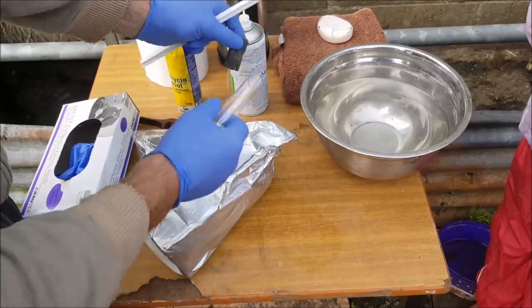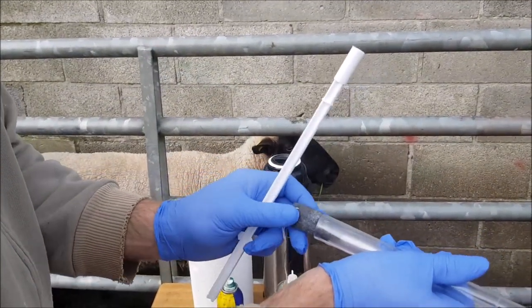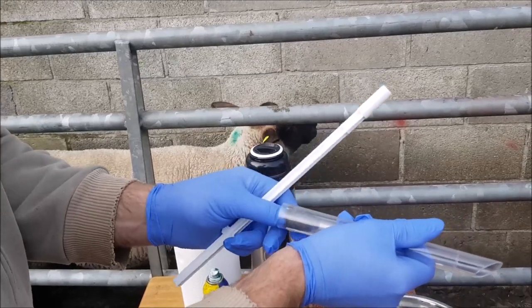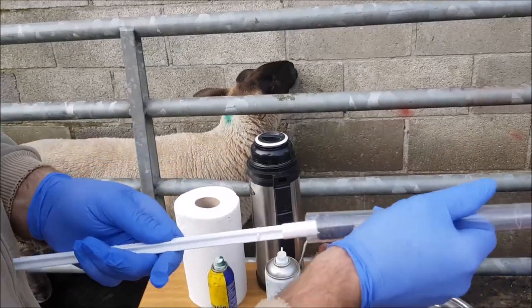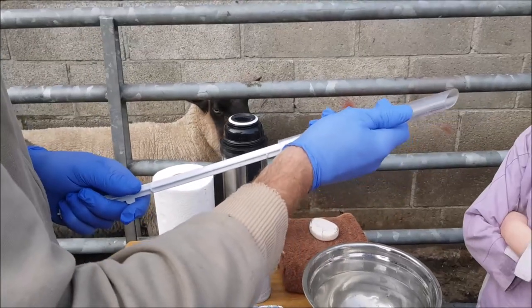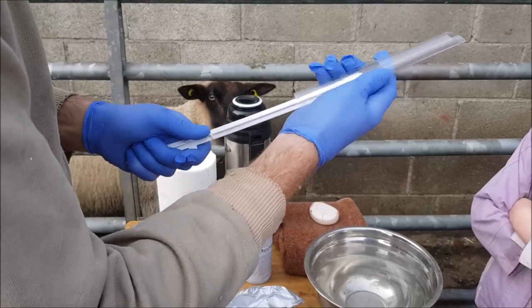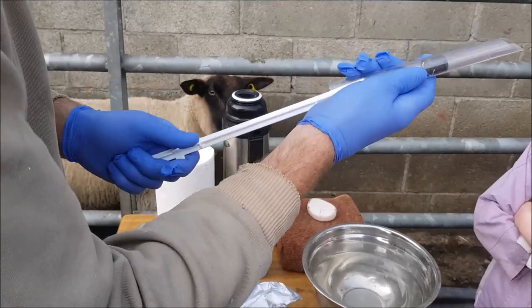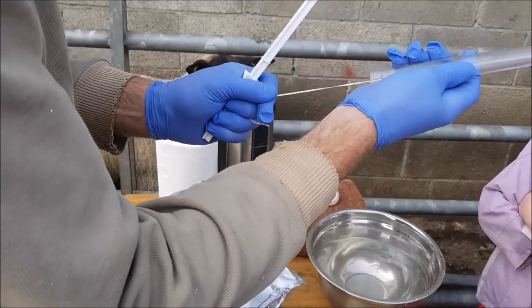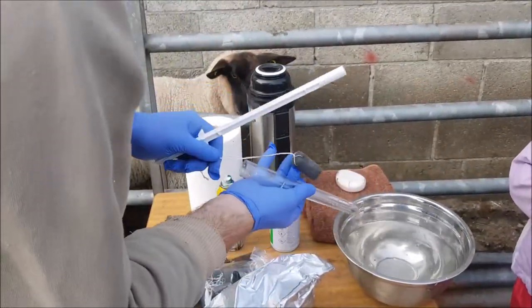Take out the sponge. You are going to obviously leave the string part to go in last, so it sticks out, and then you just push it in with the applicator. Now be careful — sometimes it is awkward enough to get it up there. Probably best if you actually lubricate the tube before you put in the sponge; it might make it easier.